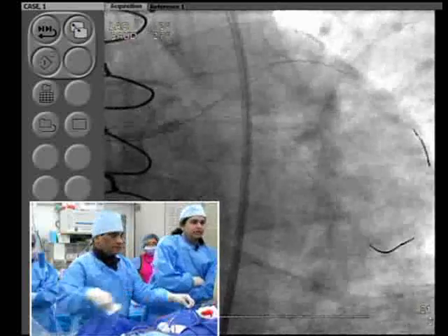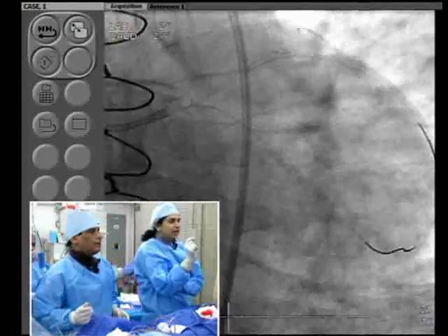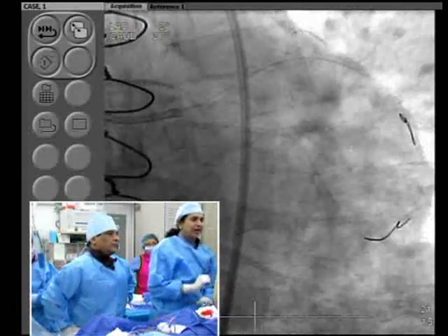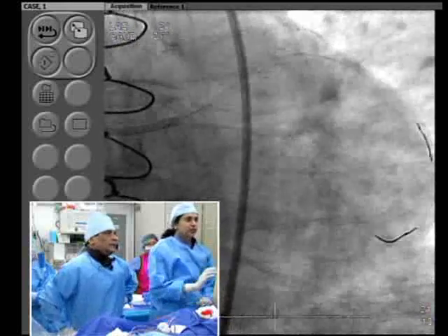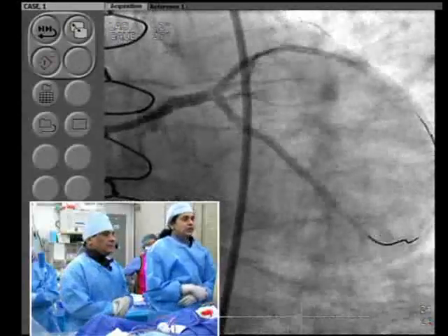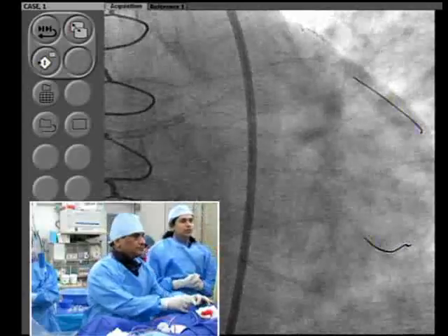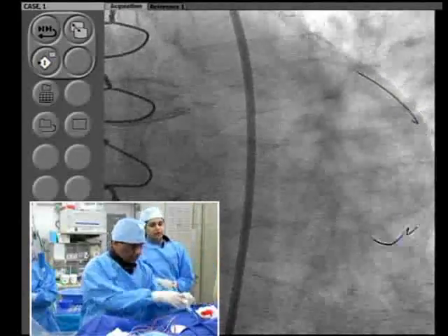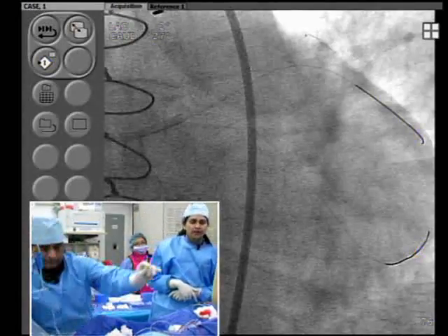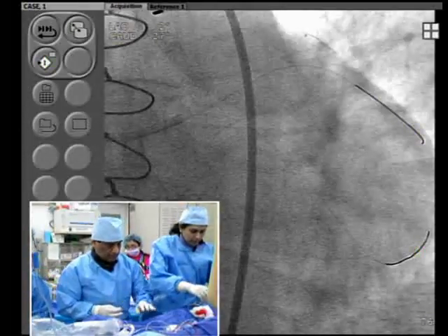And the guide is the same, the Boston Scientific Mach guides. My main reason is that you see the tip, they have a very soft tip. Even in cases where you want to get your guide into the main vessel, whether it's the proximal RCA or left main, we rarely face guide-induced dissection. The other question is, if you have a long left main, more than 10 millimeters, even if you are doing the LAD, Voda is a better guide to give you good support. What about the balloons and the stent?